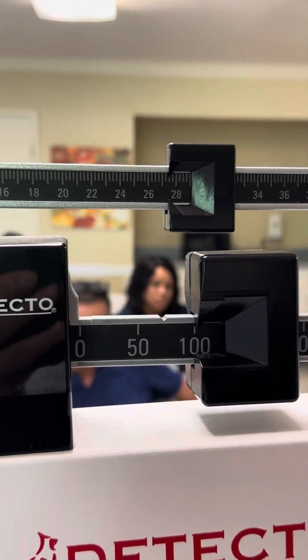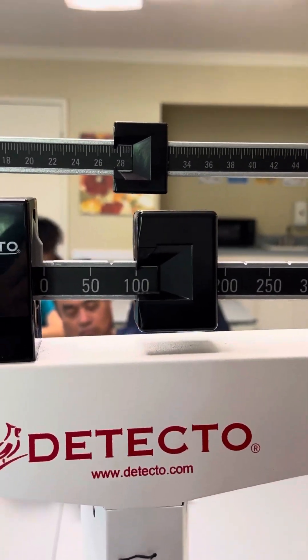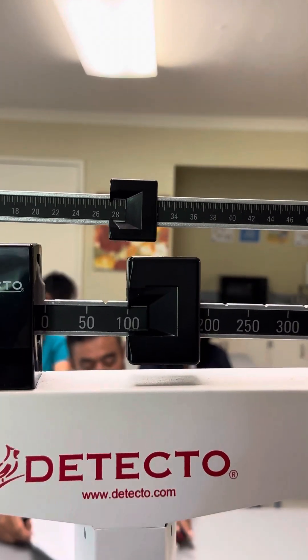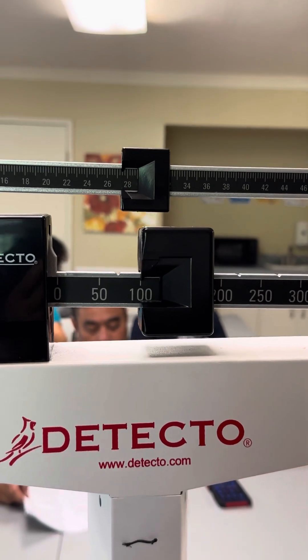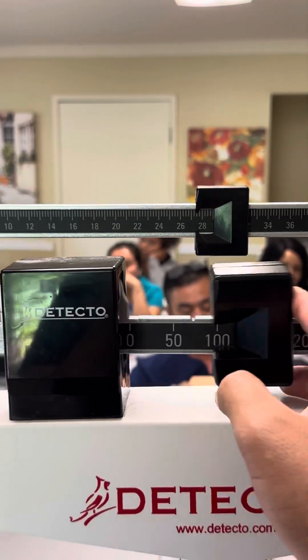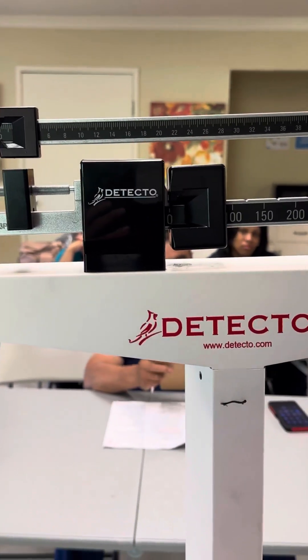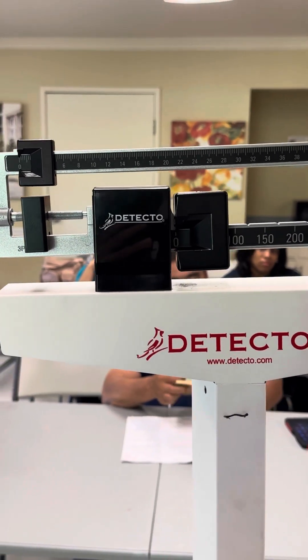After you get the reading, go ahead and ask the patient to step out of the scale. Assist the patient back to bed. Ask, are you comfortable? Here's your call light — call me if you need me. Open the curtain, wash your hands, and then report and record. Before you do report and record, put the scale back to zero and make sure it's calibrated again. That's how you weigh the patient correctly.